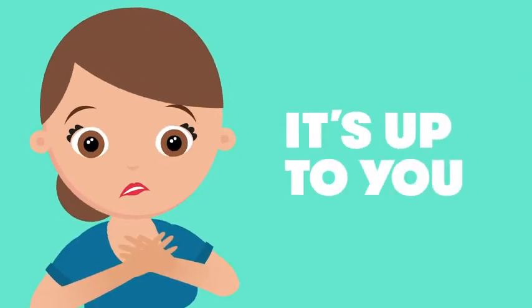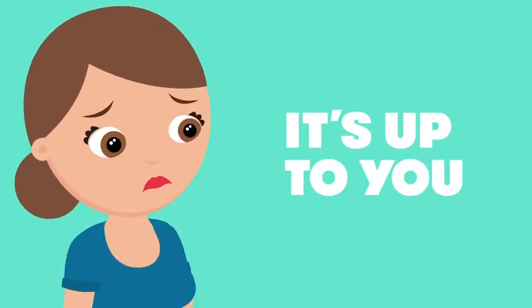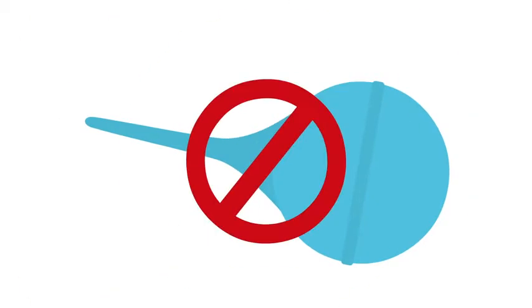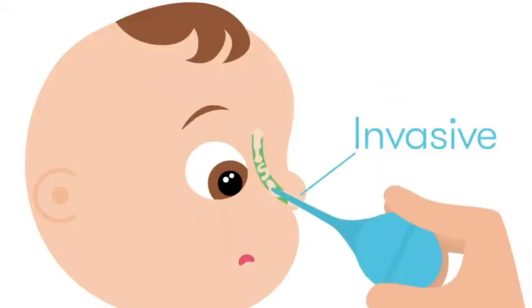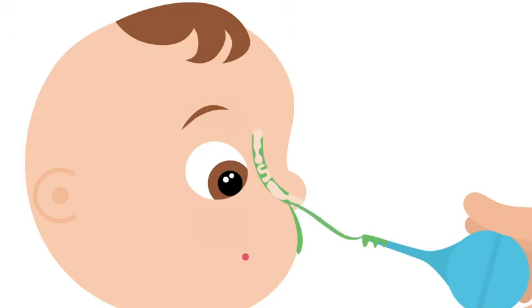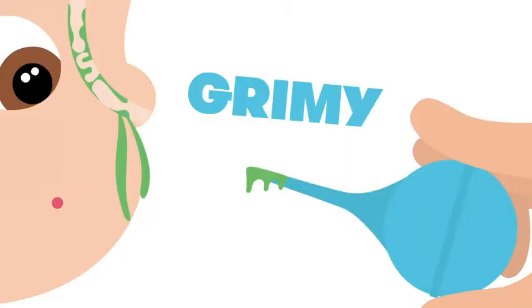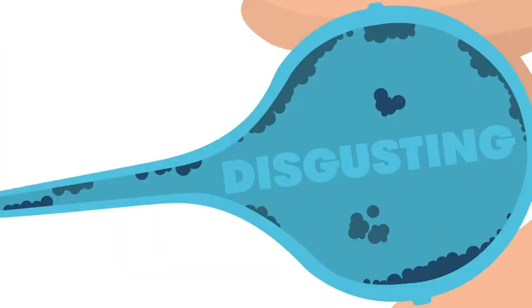It's up to you to keep their nose clean and clear, but it's snot easy with that outdated bulb syringe. They're invasive, but worse, they're nearly impossible to clean—grimy, slimy, and downright disgusting inside.